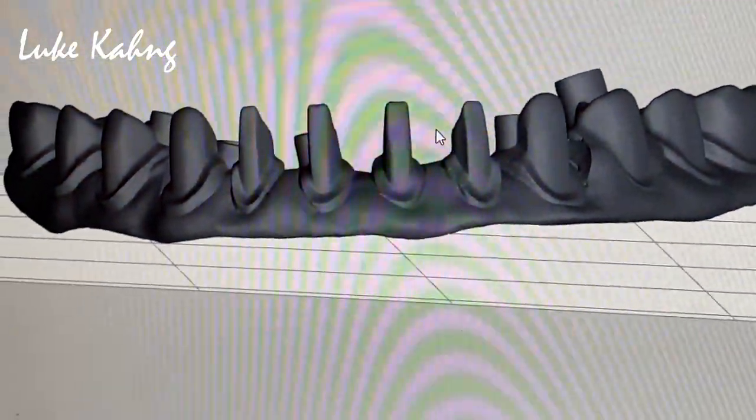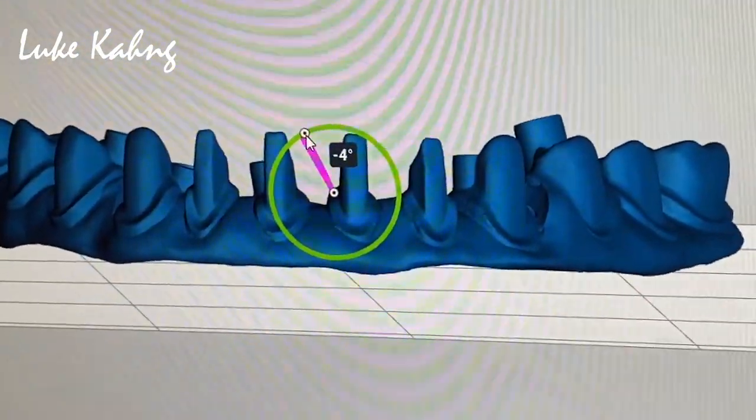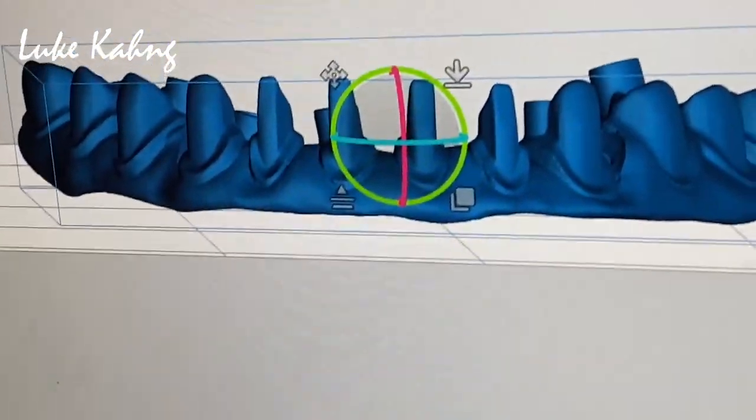Okay, so we designed with the Thimble design, which is Cyton 7 Star. So we're going to print it with the wax material.